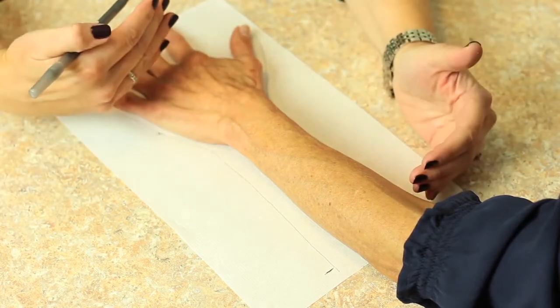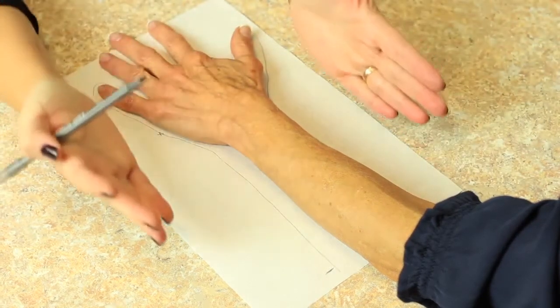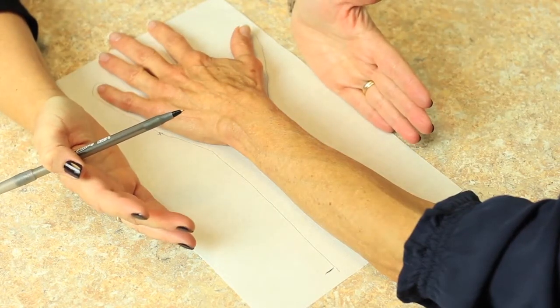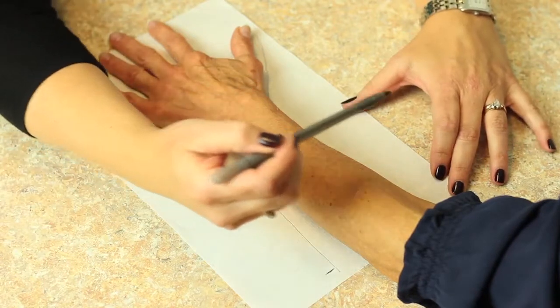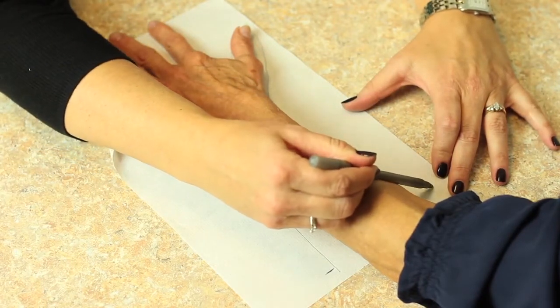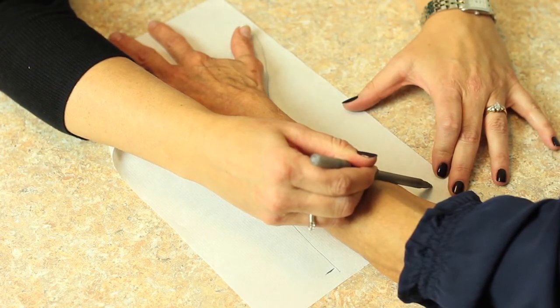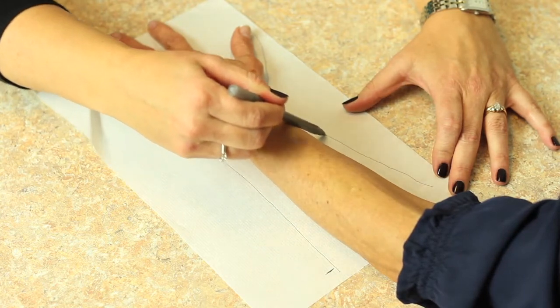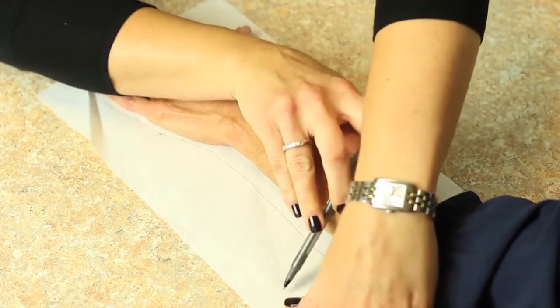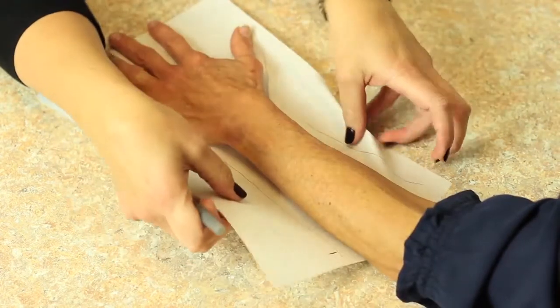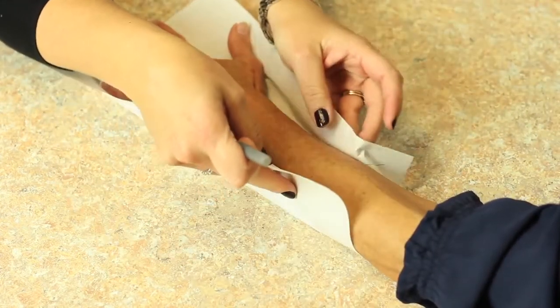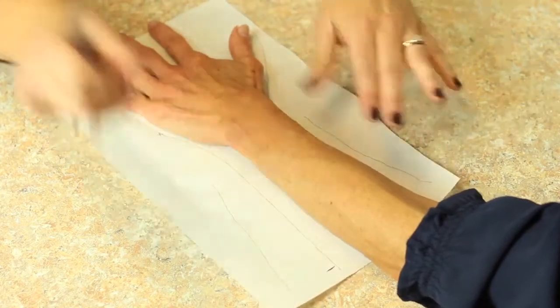And then in addition to the two-thirds the length of the forearm I want to include about two-thirds the circumference of the arm as well. So to do that one small trick is to do what's called a 45 degree angle trick. You take your pen and lay it at a 45 degree angle from the forearm. This will work all the way up to the wrist area just like this. If I lift the paper towel up you can see I'm able to obtain that two-thirds towards the circumference of the forearm.